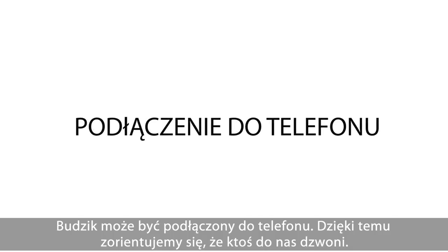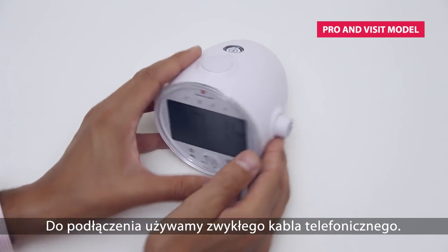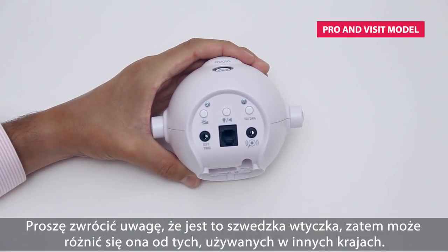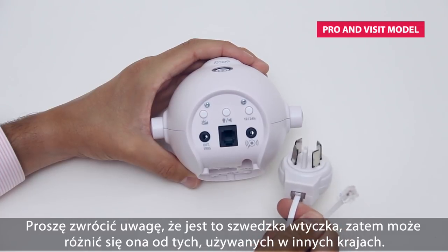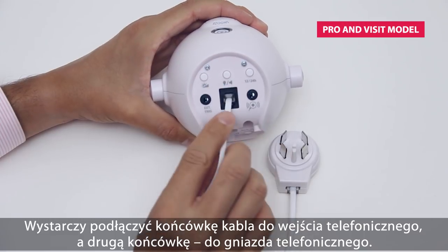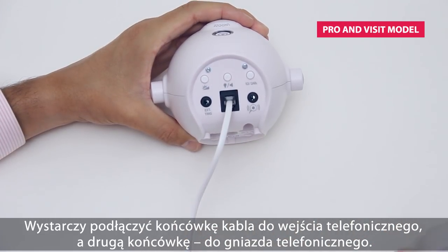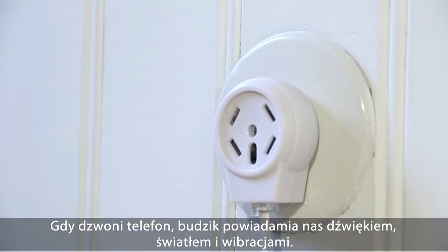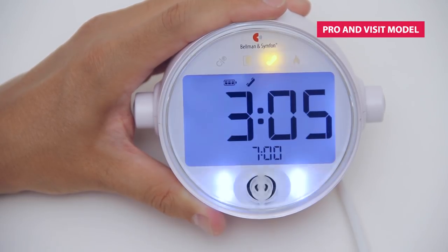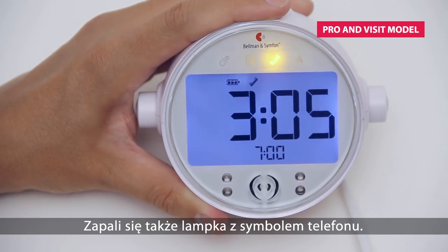The alarm clock can be connected to the telephone line to alert you when the telephone rings. This is done by using a regular telephone cable. Note that this is the Swedish version of the telephone plug and it may differ from your country. Just plug in the cable to the telephone jack here and the other end to your regular telephone jack. When the telephone rings, the alarm clock will alert you with sound, flash, and vibrations. In addition, a telephone symbol will appear on the clock face.